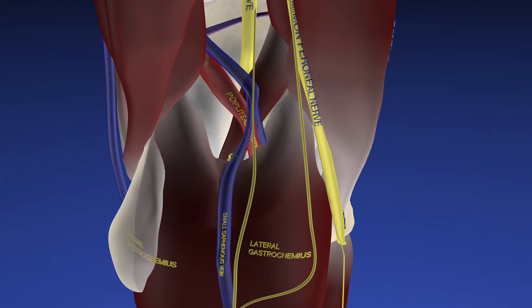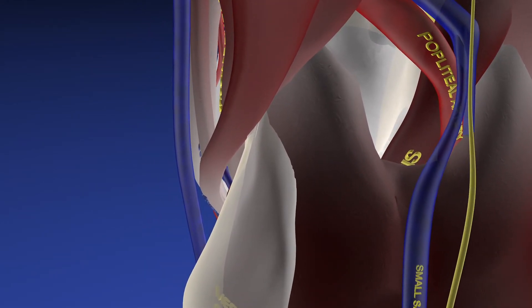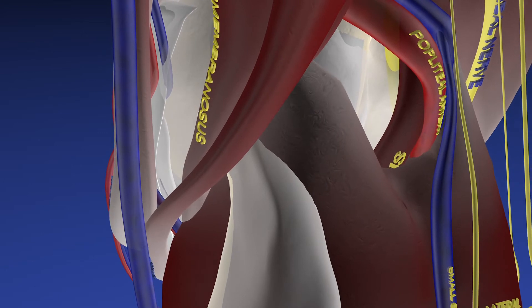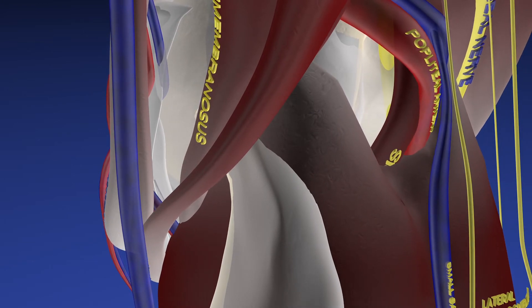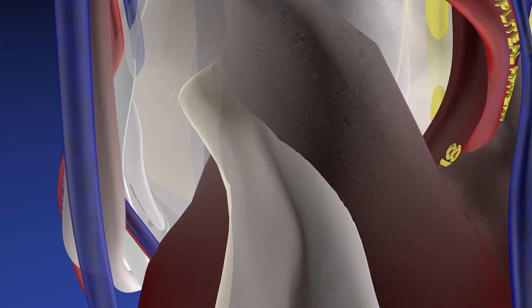Here is this patient's Baker cyst — basically a medium-sized Baker cyst. You can see how the Baker cyst wraps around the medial gastrocnemius tendon, with a concave lateral type of anatomy.